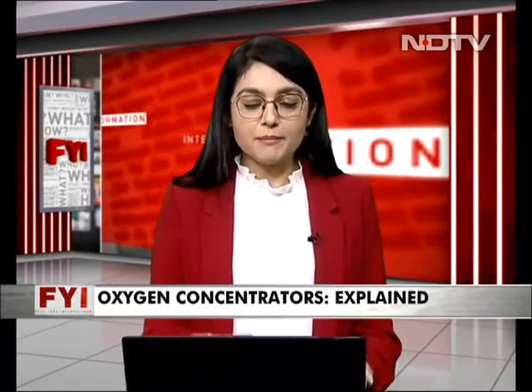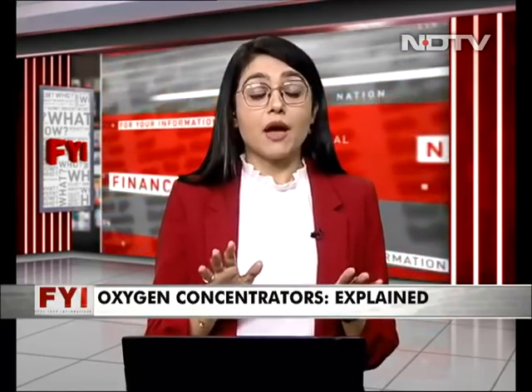All right, we'll just fix that up with him in just a moment. Sunil, if I can come to you, also the maintenance of an oxygen concentrator is not something a lot of people talk about, but if you've been using it constantly, or perhaps there is a concentrator which has been circulating between houses depending on the need really, the filters, how often do they need to be changed?